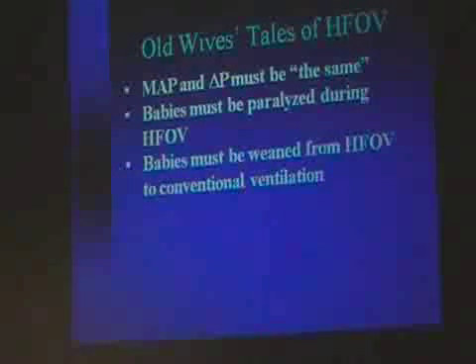Your MAP is wherever it needs to be for your optimal mean airway pressure. Right. I've just heard people say, oh, we can't wean any further because the numbers are the same. And this is why I call it an old wives' tale, okay? How low will the MAP go? It will go to 3, which is completely stupid. The baby ought to be extubated at least by 7, 8 or 6, you know.